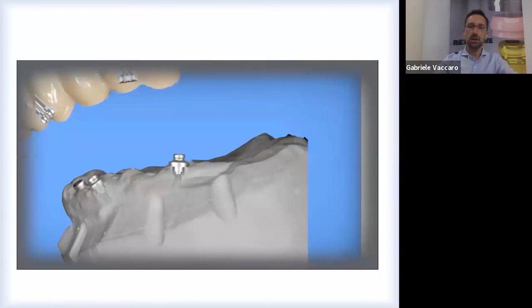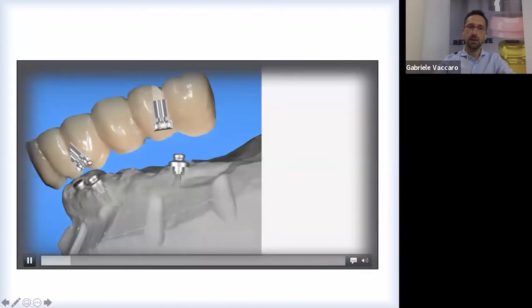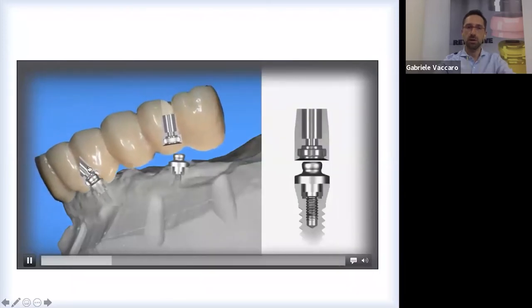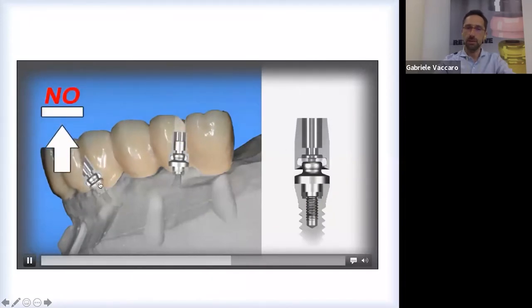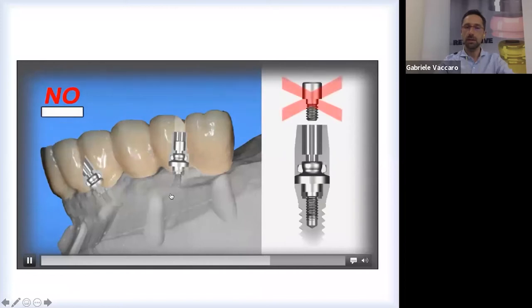So in this picture, it's easier to see the pattern of insertion and how the system works. We take advantage of this parallelism, because we have an axis of insertion, a pattern of insertion, starting from the most tilted implant and then the straight implant. After that, we fix this screw and everything is completely locked.